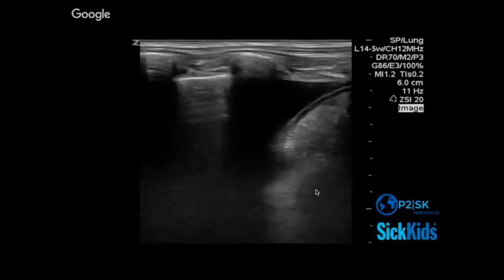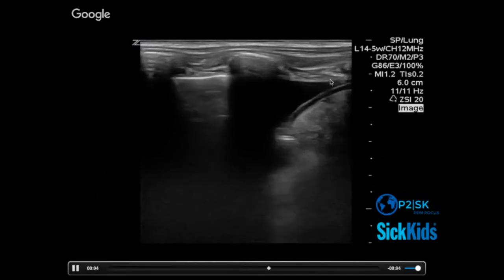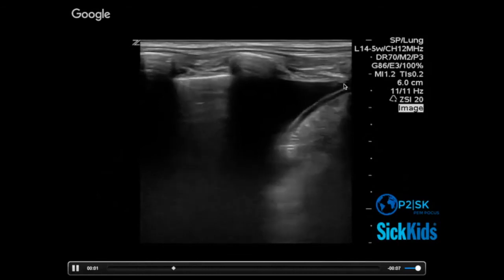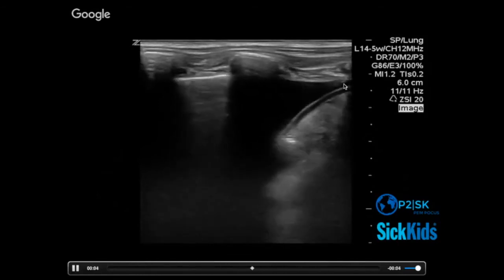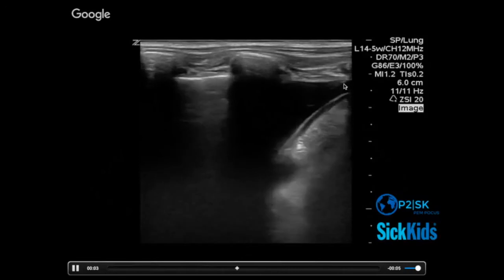And just for completeness' sake, I'm always going to say scan everything, make sure everything should fit. So you're scanning for a pneumothorax, because what if they have an obstructive cause? It's a tension pneumothorax, so you want to have a look with your linear probe on their anterior chest. And their sliding looks good. And we just want to make sure we understand what an effusion is going to look like, if it's large enough to move to the anterior chest, how it's going to look where you capture it there. You see more pulmonary edema? You may. It's variable, I'd say.